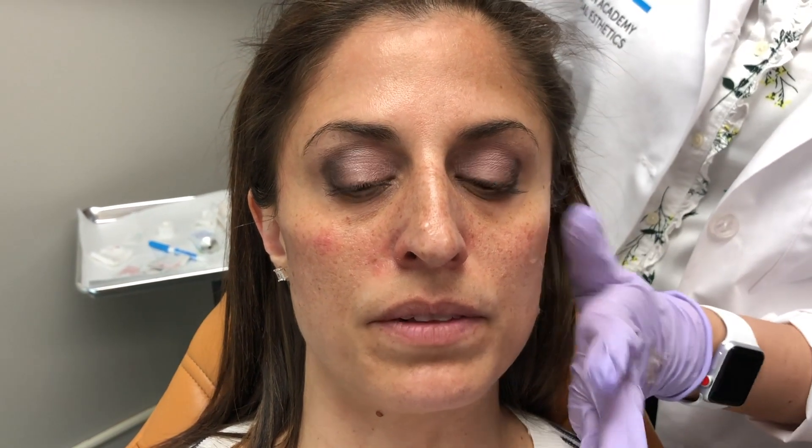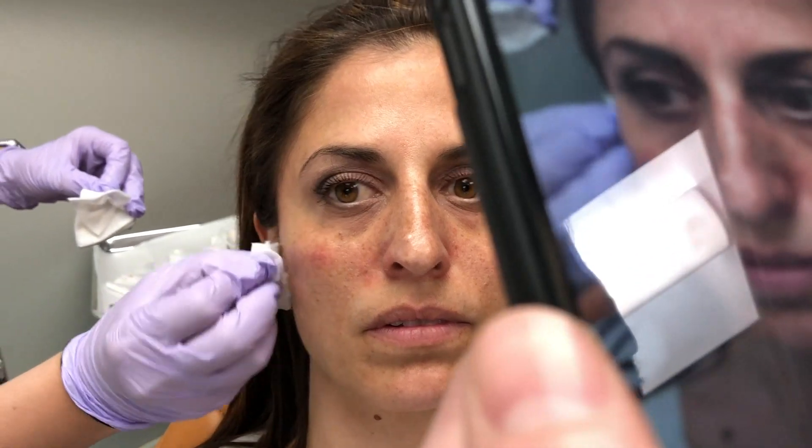Angela, how are you doing? Good — she's doing really really super. Let's clean her up a little bit and take a look one more time from the front. That was the use of Voluma — Angela, you did great. Turn your head this way just a little bit — you can really see the before and after. She's nicely matched on the cheeks on both sides, and the heart-shaped face is really coming together really well. She's a great patient and Jill, you did a great job. Thanks for being here, talk to you all soon on live.